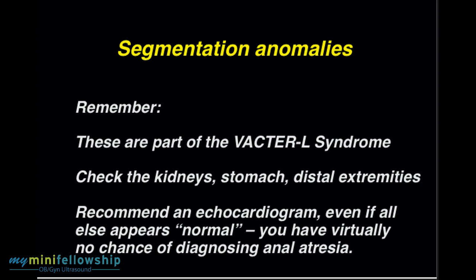Yes, I am. So this just came up the other day. A sonographer said, well, I usually look for the anus and I usually see it. And I thought that excluded anal atresia. And I said, okay, that's a good point, that looking actually for the anal dimple is something that I would do being sent a patient for the VACTERL syndrome. And if you have sonographers that are sufficiently sophisticated to look for that, great. Again, my experience is that we have not done well at diagnosing anal atresia.